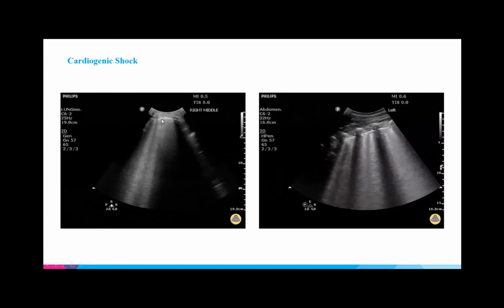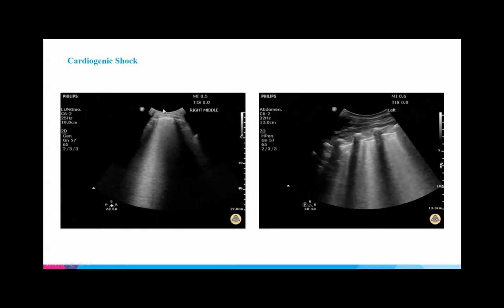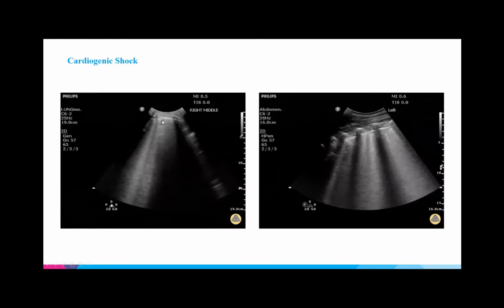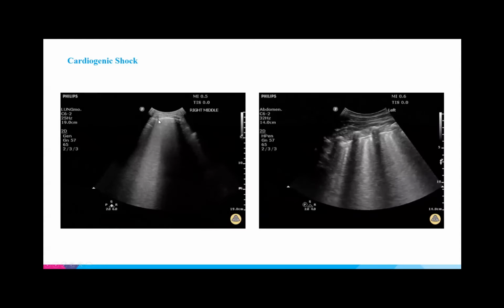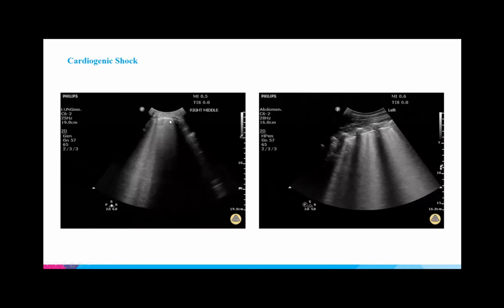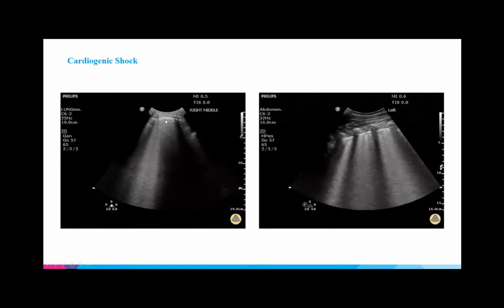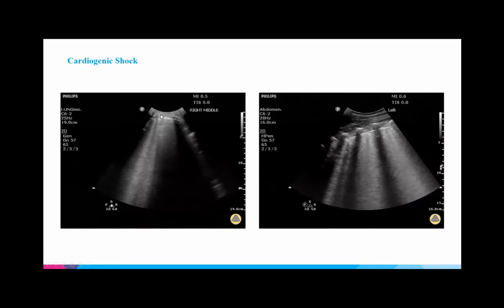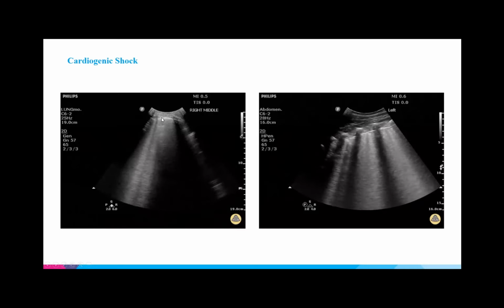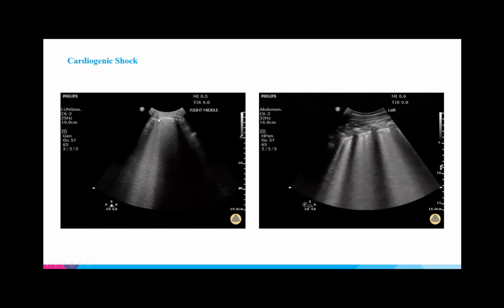And notice, with pulmonary edema, like I mentioned before, if you see B lines, you always want to pay attention to the pleura. If it's nice and smooth, that'll be more indicative of something like pulmonary edema. Whereas if it's very irregular and nodular looking, lumpy, bumpy is what's been described in the literature, that would be more indicative of an inflammatory or infectious process. So in both of these instances, the pleura looks nice and linear and smooth.